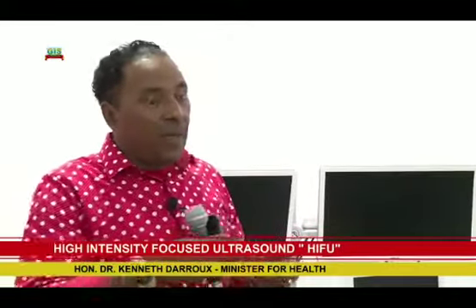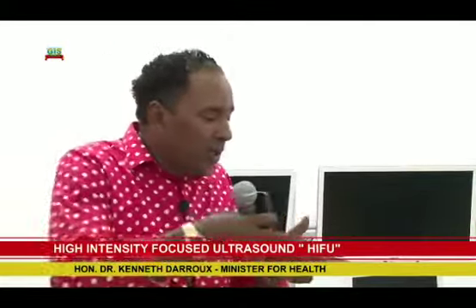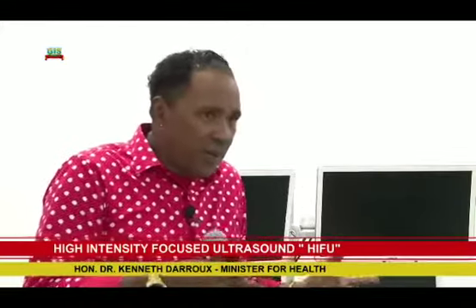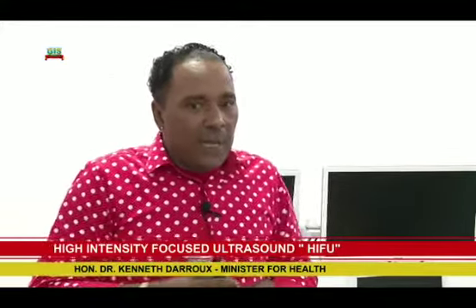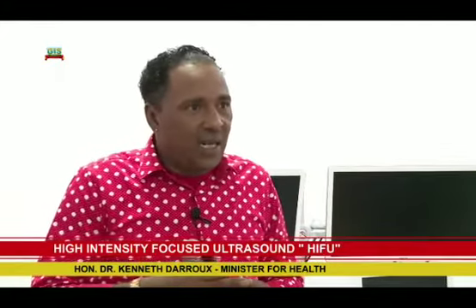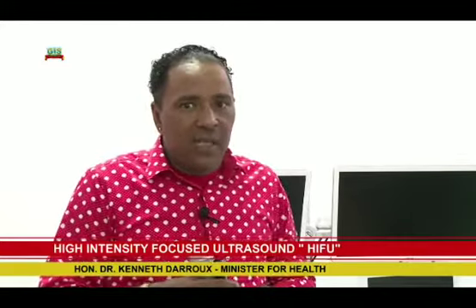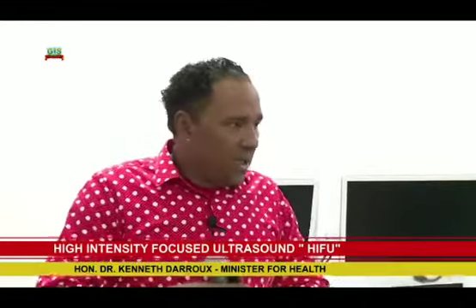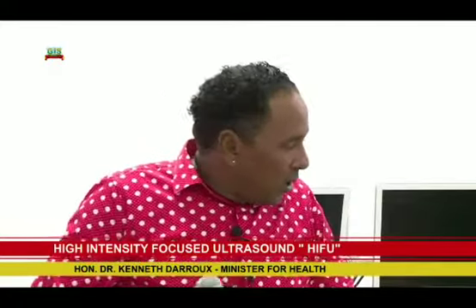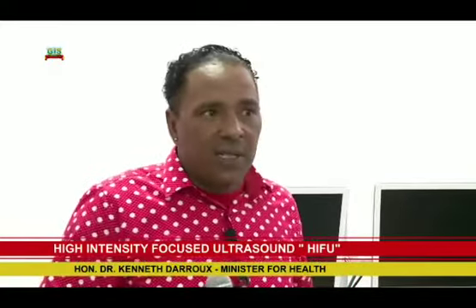When you focus the ray, it can work in 2 ways, either through mechanical disintegration, or you focus it so that you produce heat energy to actually burn the tumor. So of course you will feel pain in the area for a little while. As I said, it has been cleared by the FDA that these side effects are really at a minimum. So all of these scaremongering tactics to get people to understand that we're just making a big hullabaloo about nothing. Okay, here you have it for yourself, folks.